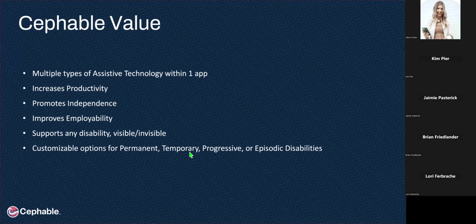We're also finding that we're not trying to fully replace the keyboard and the mouse, but we like to think of Cephable as an additive feature that you add on top of what's already working, dancing alongside other parts of a suite of assistive technology that is working for an individual. But if something is hard, so we have users who use QuadStick, and they find that programming some of those inputs can be really challenging. We're not saying don't use certain hardware AT that's working, but how can Cephable provide value on top of what's already working?